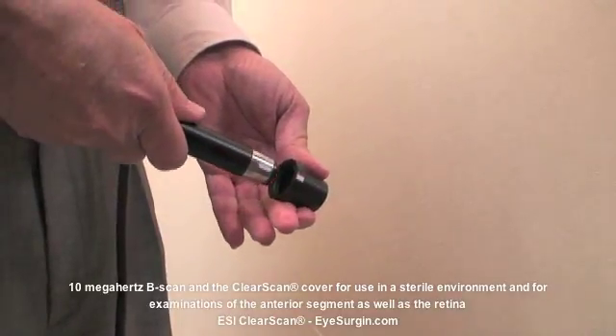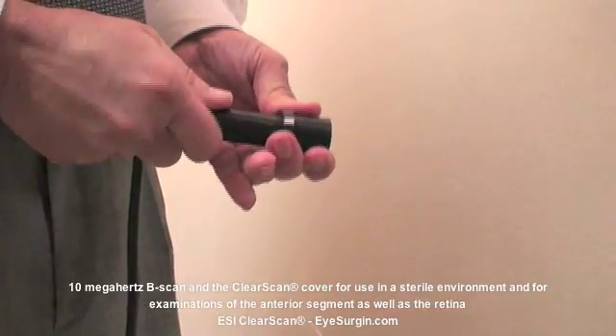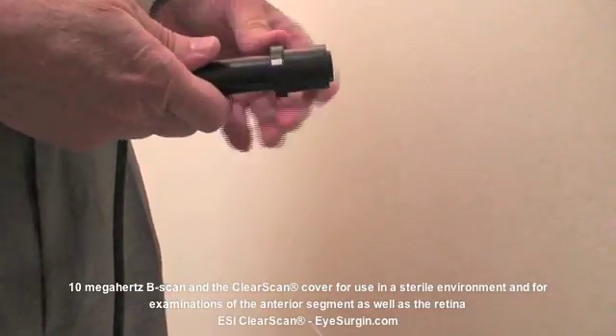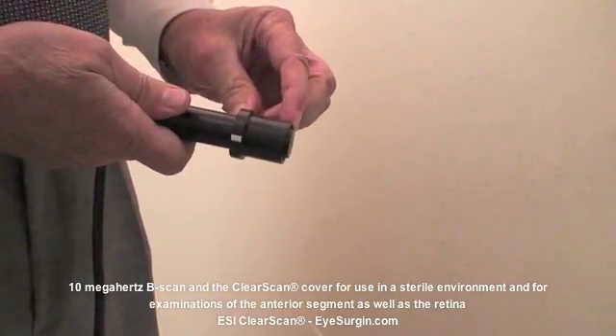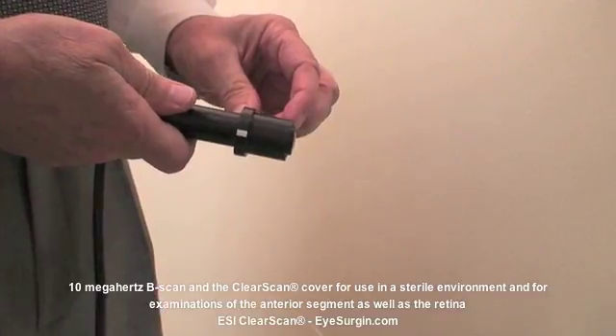The Clear Scan can be used in conjunction with the standard 10 MHz probe with an adapter for both retinal and anterior segment ultrasounds. For a conventional B-scan at the back of the eye in orbit and an anterior segment examination, the adapter must first be affixed to the ultrasound probe.